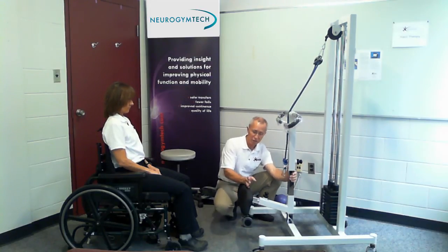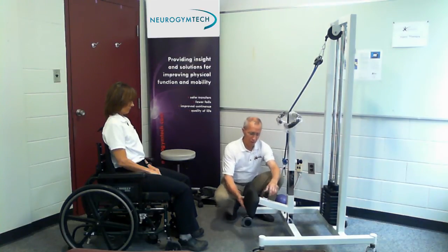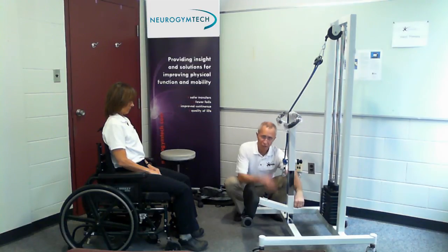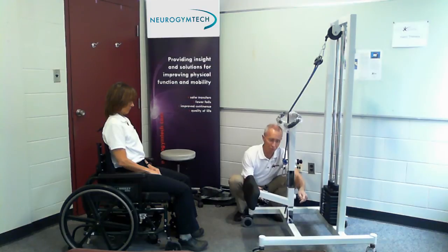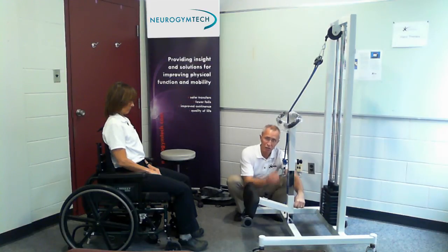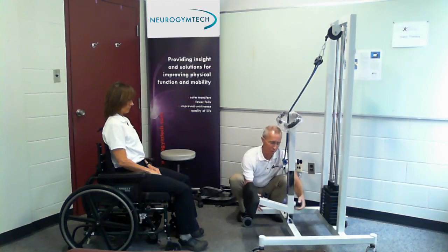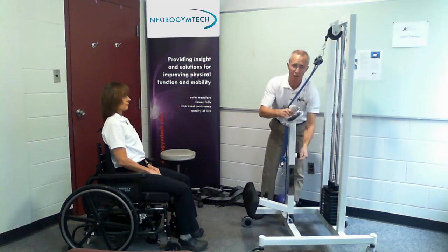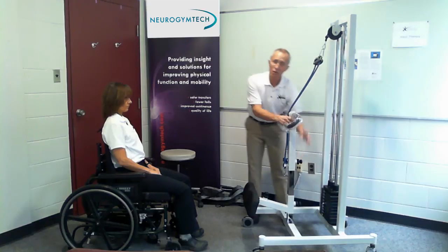Try moving the knee pad back and forth. The second knob controls the height of the knee pad — it can move up or down. We'll show you the appropriate height once we move the patient back in. It's easier to move it when you hold it by the adjustment knob and lift it up and down. The third knob moves the handlebars up and down. Those are the three main adjustments — you can stop the tape and try those if you'd like.